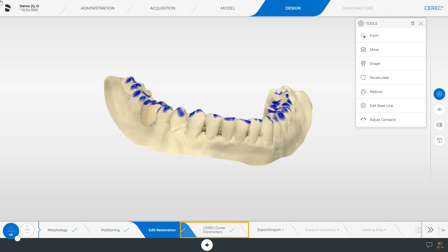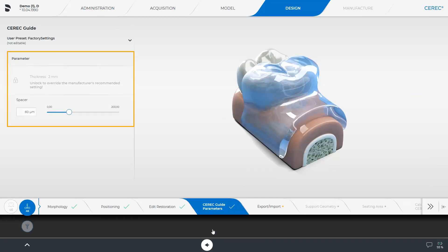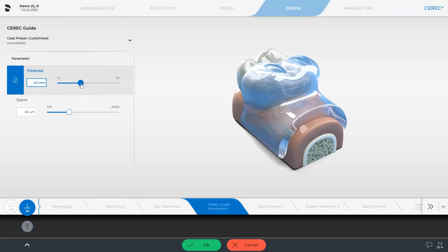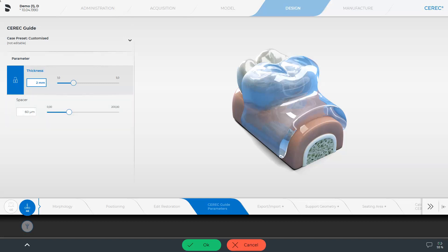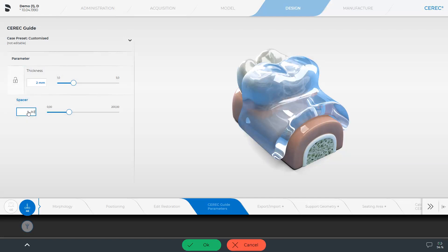In the next step, CEREC Guide parameters, the thickness and spacer are already present. Both parameters can be adjusted separately. The thickness parameter is marked with a lock, since 2 millimeters is a manufacturer recommendation. By clicking on the lock, the parameter is unlocked. Changing the thickness means that the guide is changed in the support area on the teeth — a thicker guide is stiffer and less flexible. You can either move the slider or overwrite the numbers in the window. For example, reducing the spacer results in a tighter fit of the guide; if the spacer is raised, the guide can be attached or removed more easily. Finally, you can discard the change or, as in our case, confirm it by clicking OK.